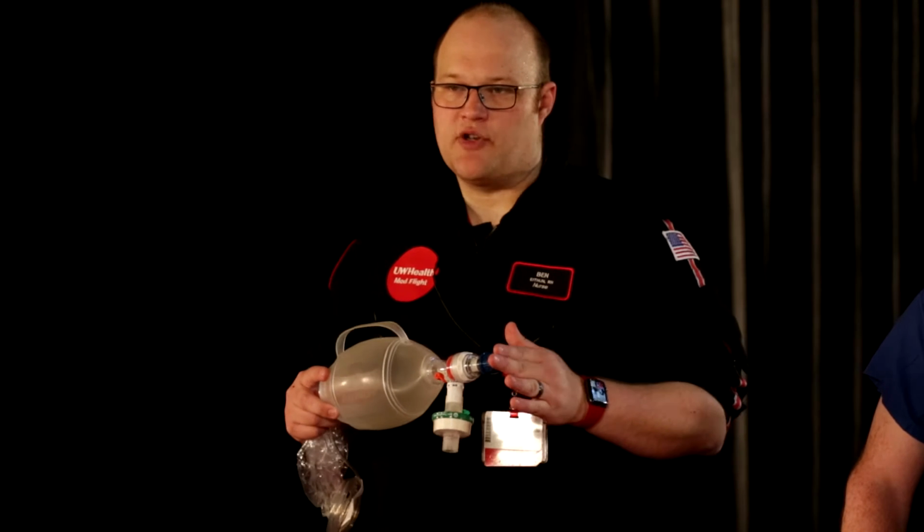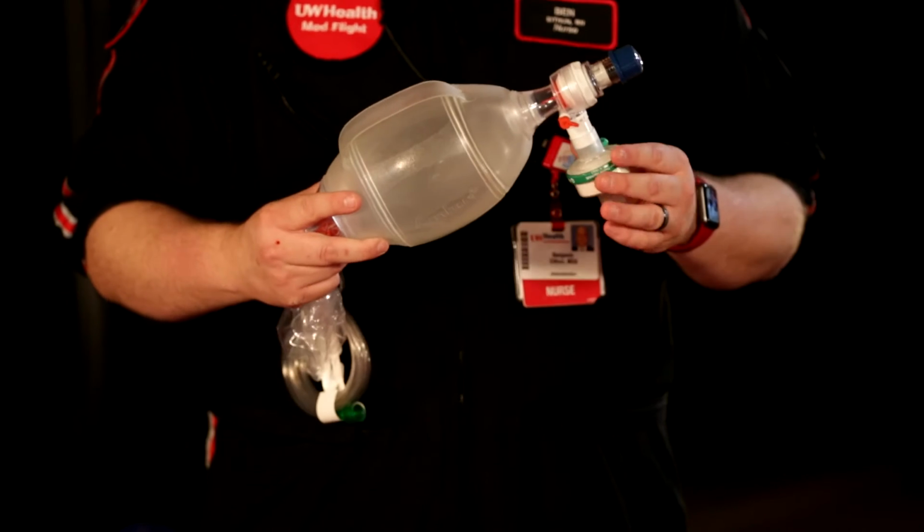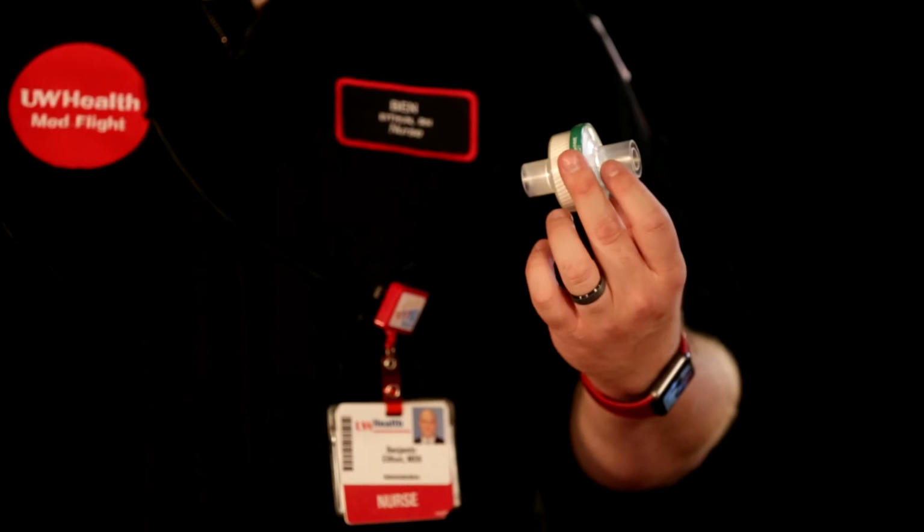Also, you want to know if your bag has a PEEP valve. If at all possible, make sure you do have one, especially in kids, because as you decrease that reserve that they have, you can get into trouble. This one also has a filter on, and so in the time of infectious disease, you want to make sure that anytime there's a risk of spreading infection, we take steps to mitigate that.